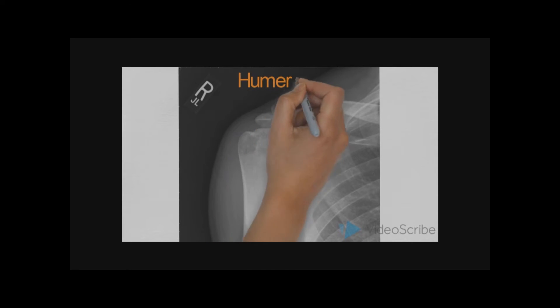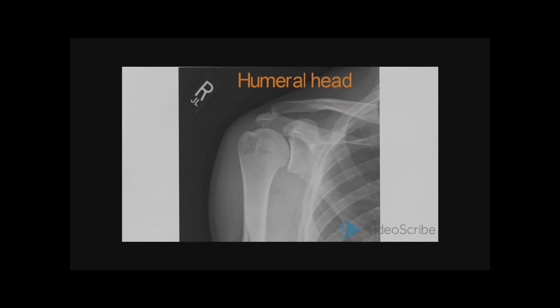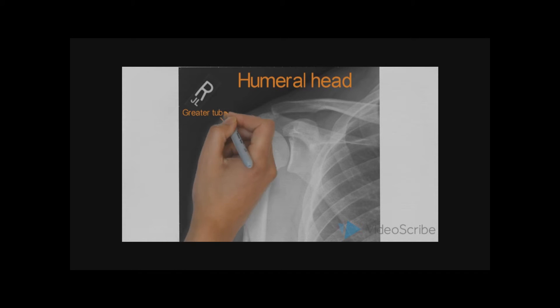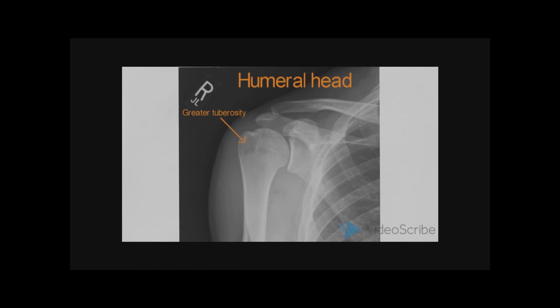Then we move on to assessing the humeral head, or epiphysis. First, we assess the general alignment with the glenoid cavity. Then we assess the greater tuberosity. We then look at and identify the lesser tuberosity, and we also assess the articular surface of the humeral head.